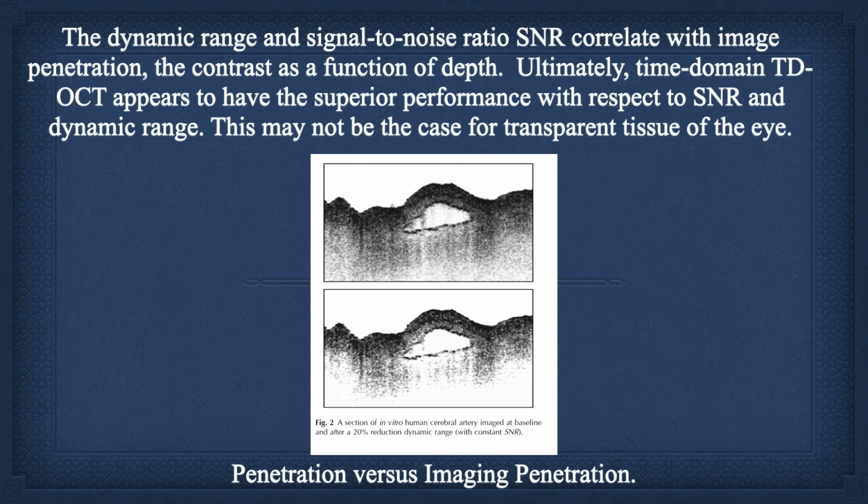And so noise and noise-like things are going to play a big role in causing problems with this. Now, ironically, SS-OCT made it big because of cardiology, but in the eye, because the eye is transparent and the dynamic range between the maximum signal and the minimum signal is so low, these may not be that important. And so for ophthalmologists, it's not clear if time domain would be that useful for ophthalmology.